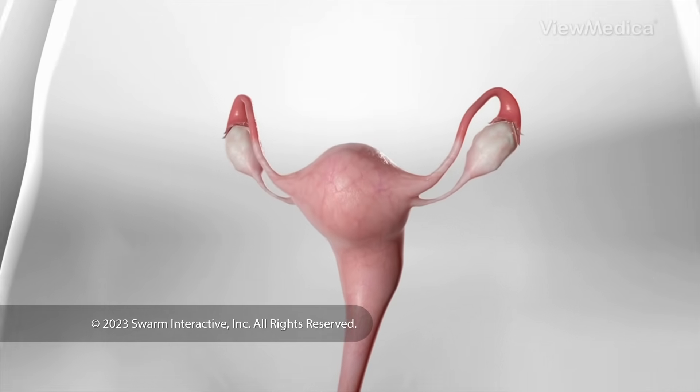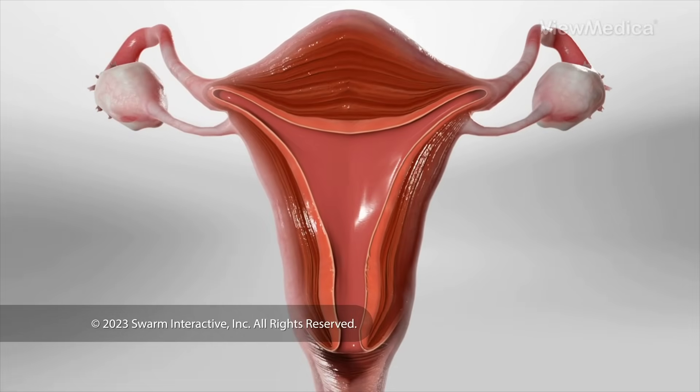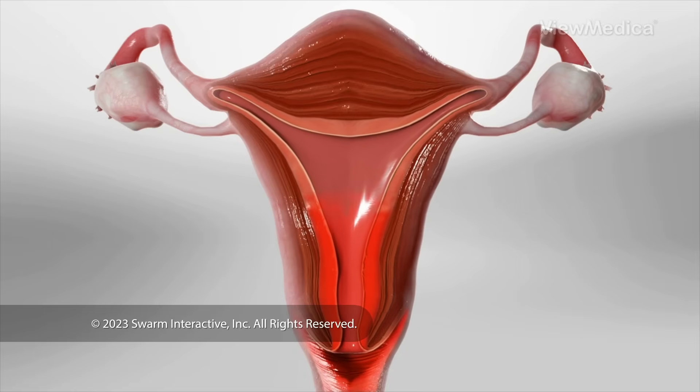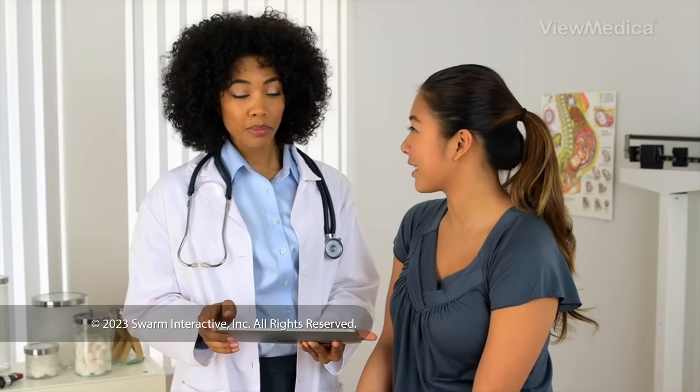This procedure destroys the endometrium — the layered tissue that lines the inner wall of your uterus. This tissue sheds when you have your monthly period. Ablation is sometimes used to treat heavy menstrual bleeding. It is used only when you do not want to get pregnant in the future.